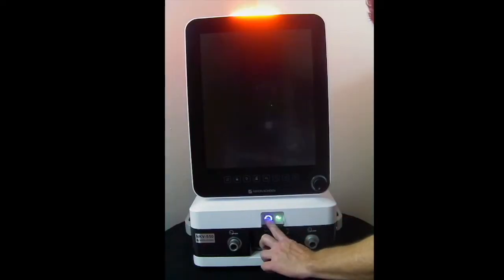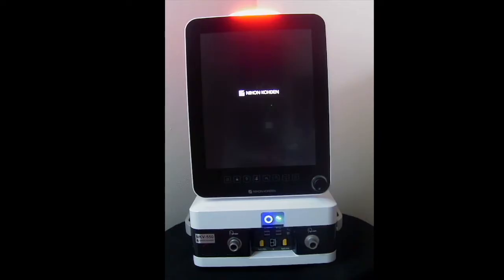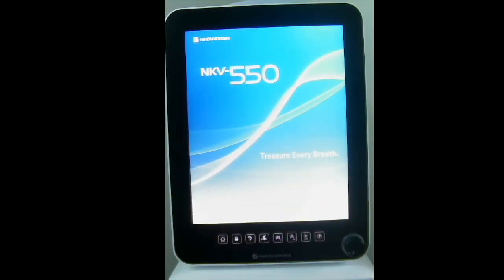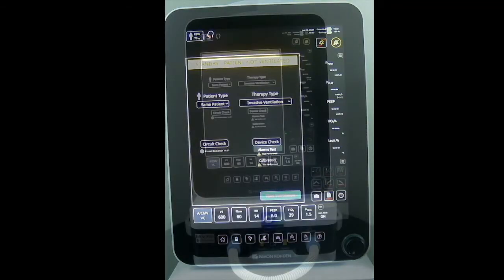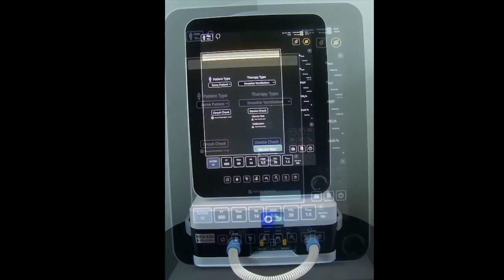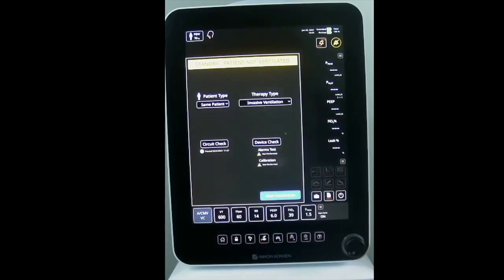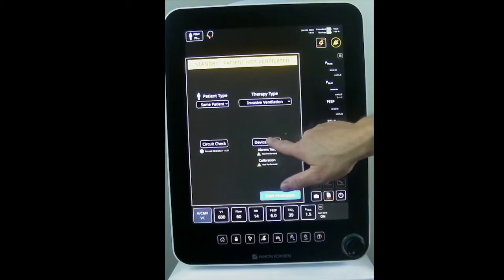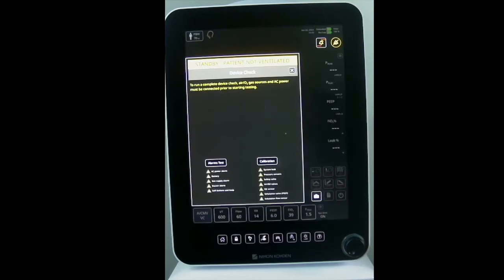Power on the ventilator to perform a device check. For the device check, I need to connect the testing tube. Select device check from the standby screen and ensure the ventilator is hooked up to air and oxygen.